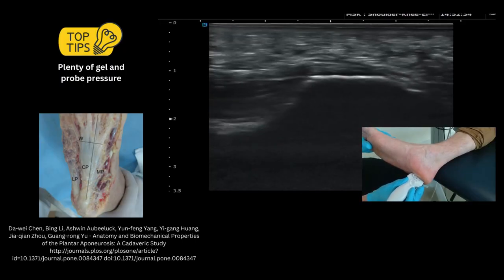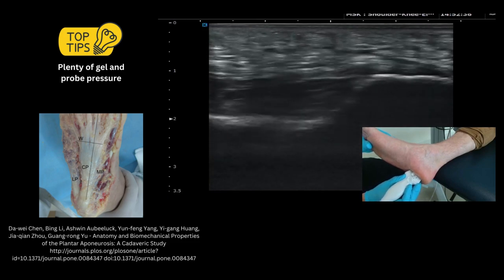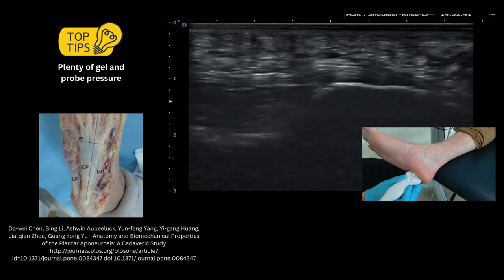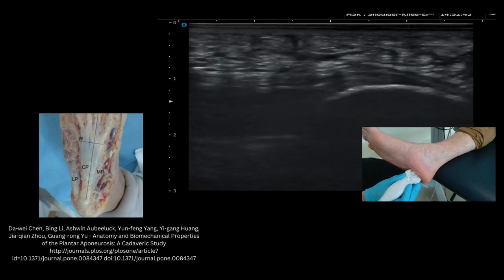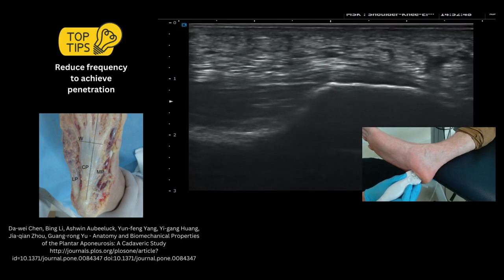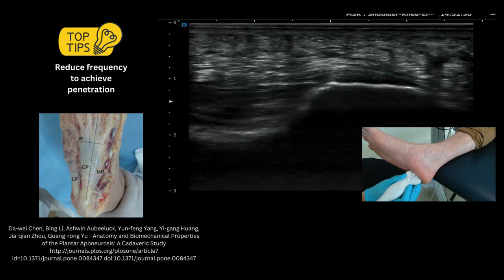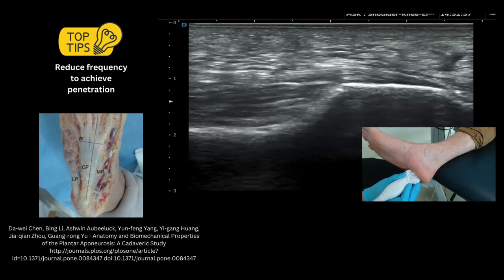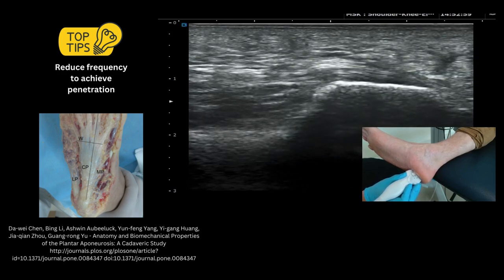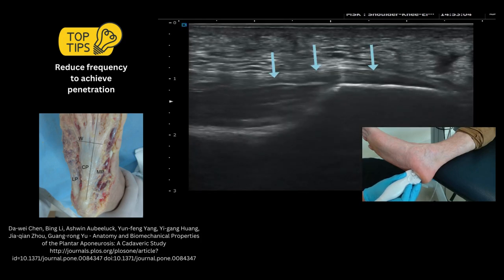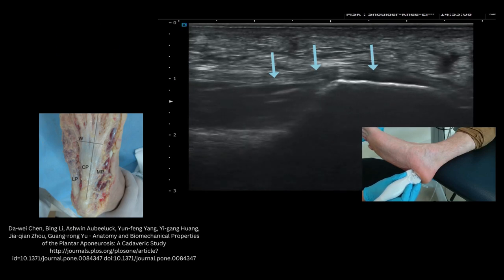This is a live scan of the plantar fascia. The patient is lying and we can see the calcaneus very nicely. We can use the windlass mechanism to ensure that we're on the right structure, optimizing our depth to see this image very clearly. Reducing frequency will enable greater penetration of sound waves but potentially lose resolution — this lower frequency image shows the plantar fascia nicely but with a little less resolution. Changing frequency back up again, you can see the plantar fascia very clearly.